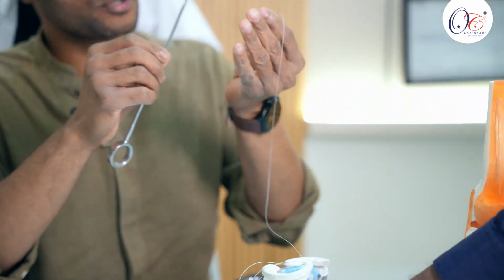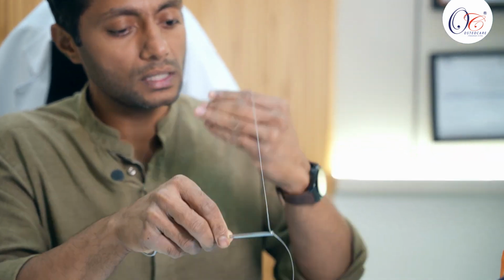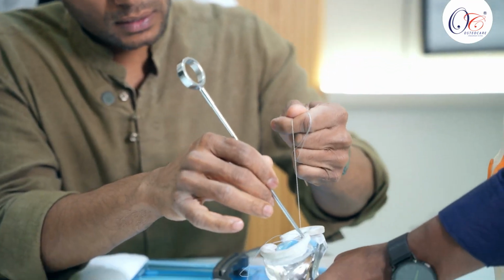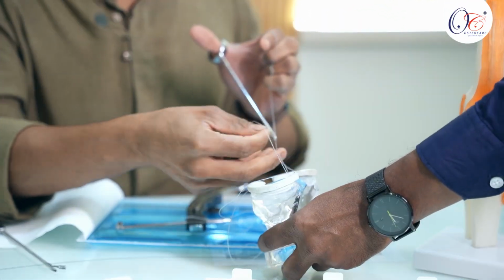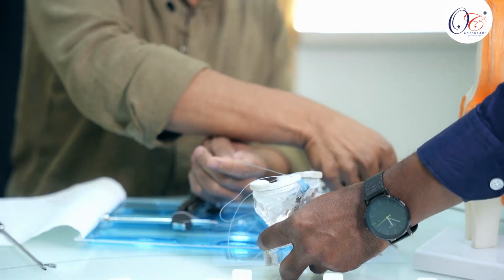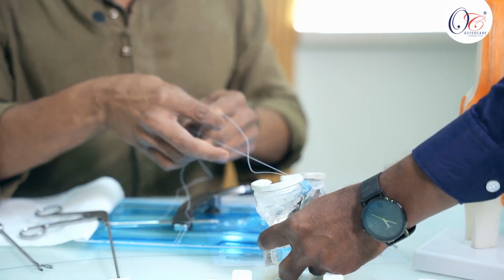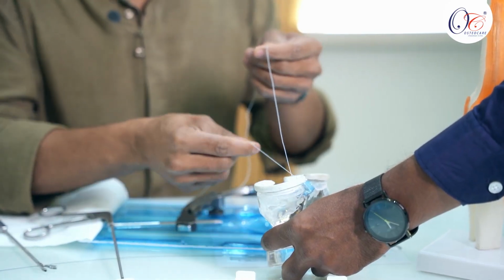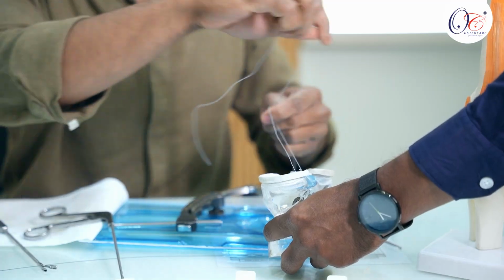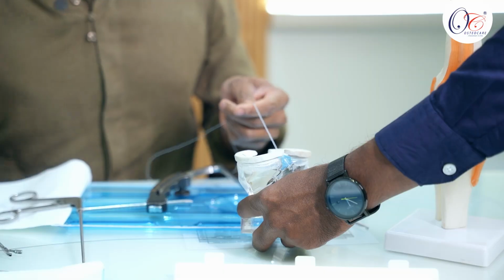This is called a knot pusher, where we use it to tie the knot securely over the repaired meniscus like this. So we put 1 or 2 knots and then through the same cannula, we cut the knots closely. So in a similar way, we put the knots for the other pair of sutures as well. So this is how it is repaired.